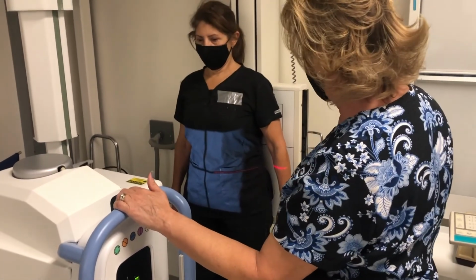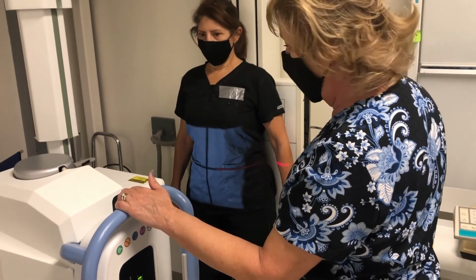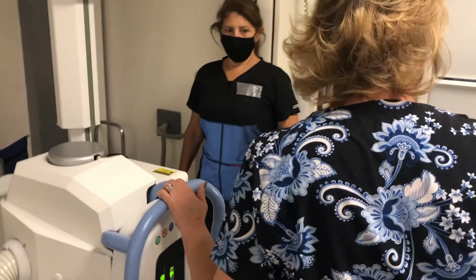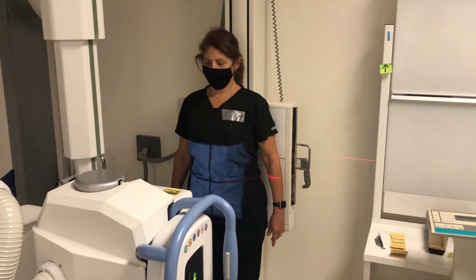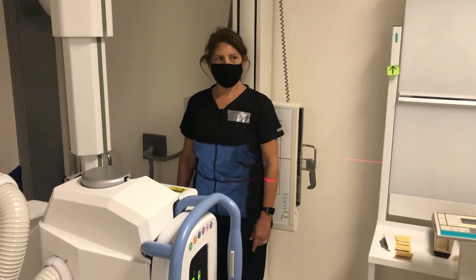Her kidneys have dropped a little bit. I've got my left marker, my post void on there. We're ready to go. Okay, Raina, one more time. Take a breath in, blow it all the way out. Hold it out, don't breathe, and expose.